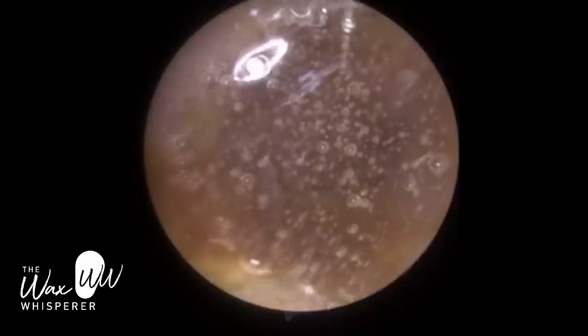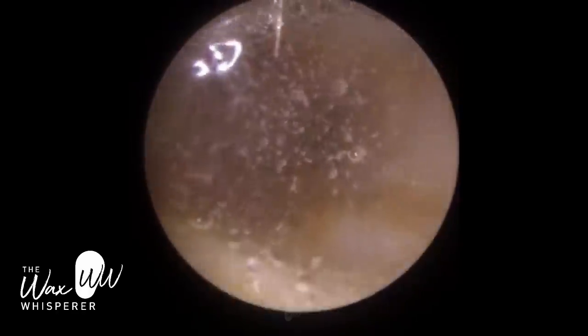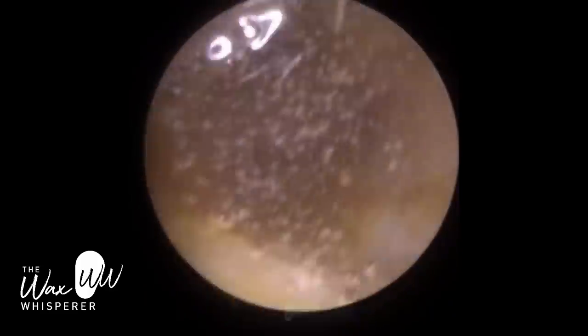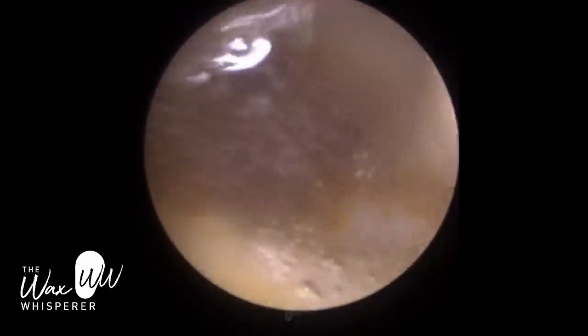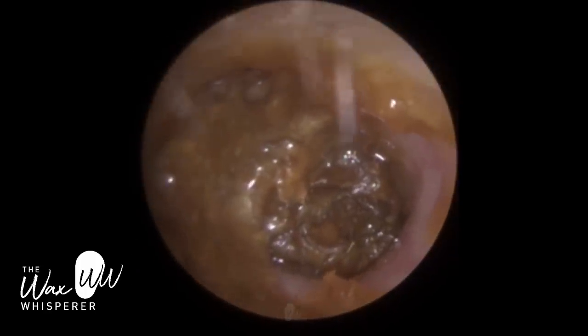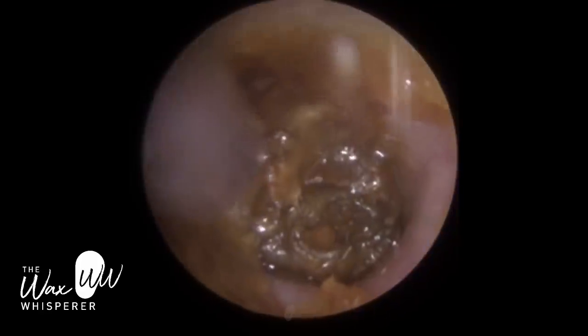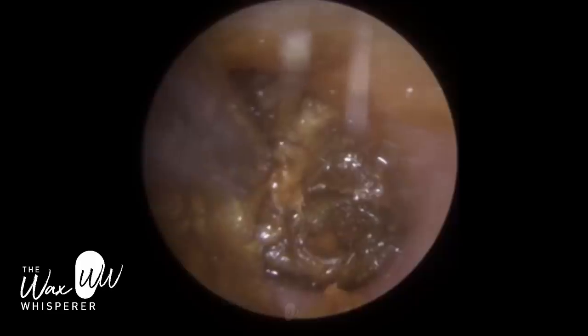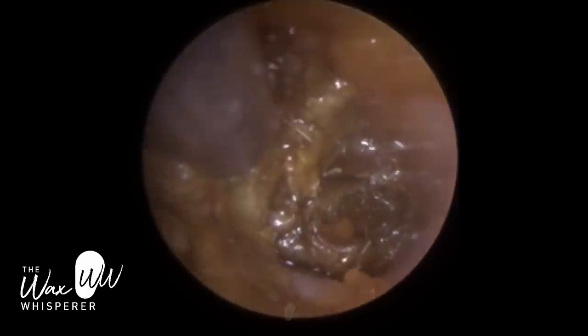I've just put some olive oil drops in here just to bind it. On this ear, the patient had already been using the drops. Her right ear was also very blocked; however, the patient didn't use any drops in the right ear, because the patient reports a possible perforation — a hole of the eardrum, a tympanic perforation.